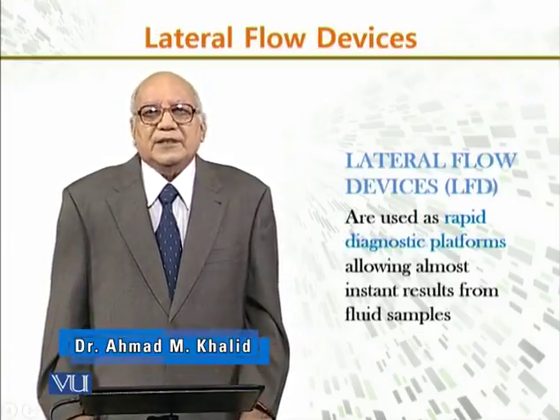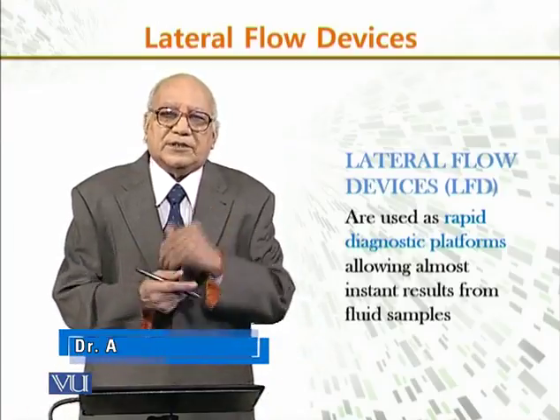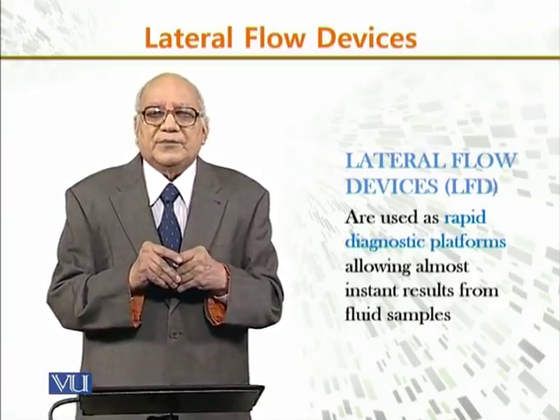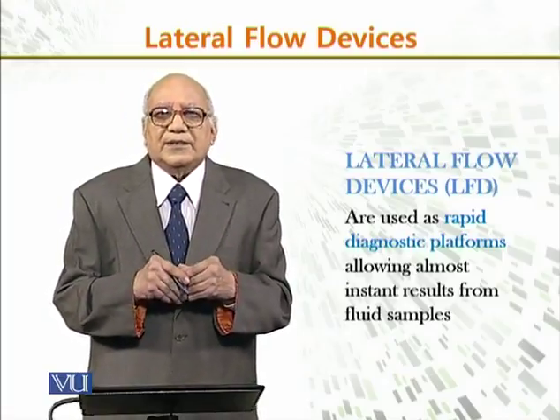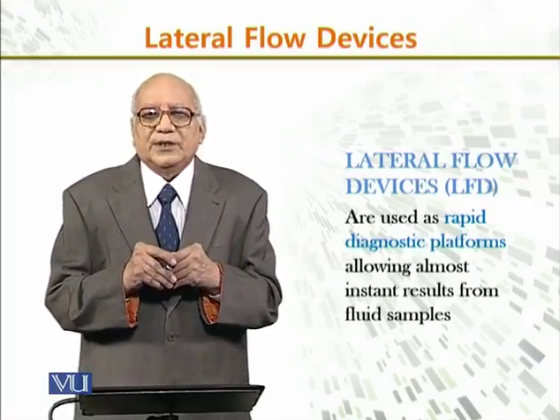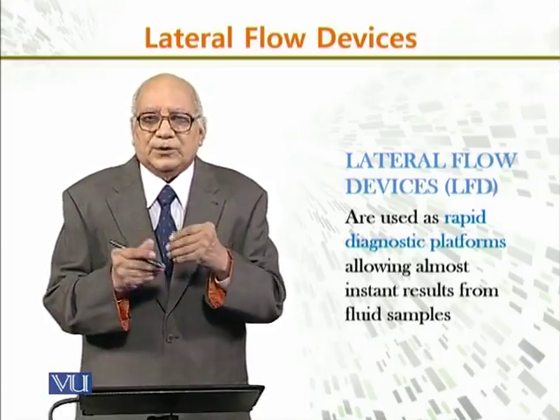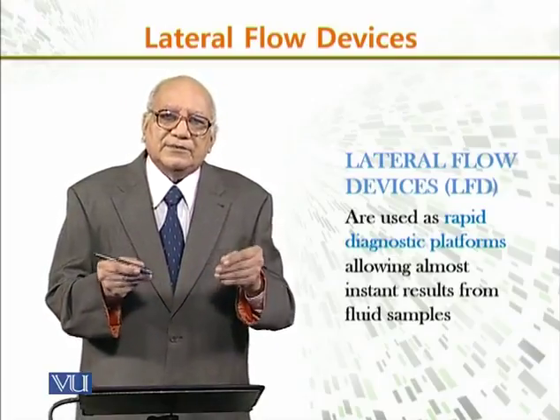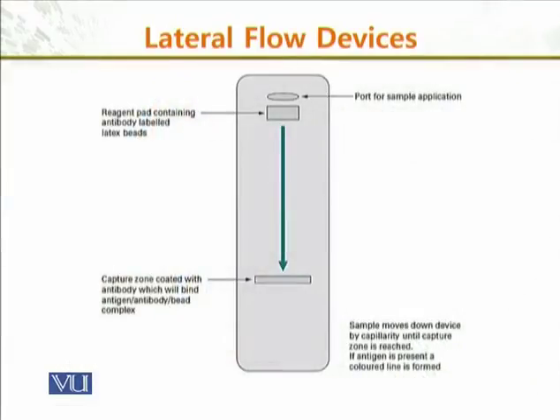Lateral flow devices, LFDs, are used as rapid diagnostic platforms, and they allow almost instant results from fluid samples. We can use them as a diagnostic tool, as a diagnostic aid, and they are very rapid, very precise, and provide an immediate reaction.